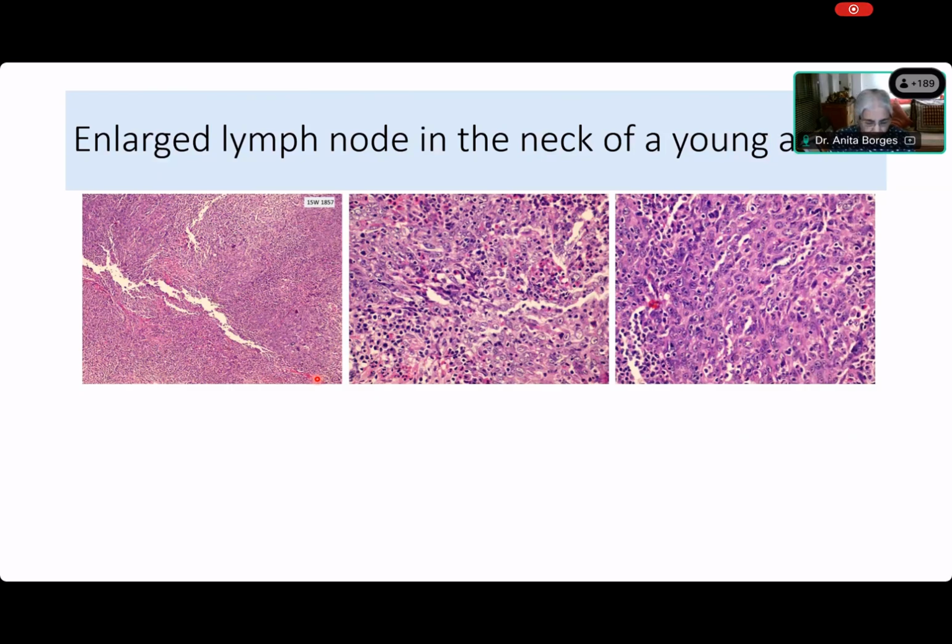Do you think it's a lymphoma? Do you think it's a carcinoma? Do you think it's a sarcoma? Do you think it's a melanoma? Do you think it's a neuroendocrine tumor? Can you tell me, Aishwarya? Ma'am, I'm asking you a question. So would you consider this a poorly differentiated tumor? And if so, where does it fit? Is it monomorphic? Is it pleomorphic? And if it is one or the other, is it epithelioid? Is it mesenchymal? Is it small cell? Now come on.